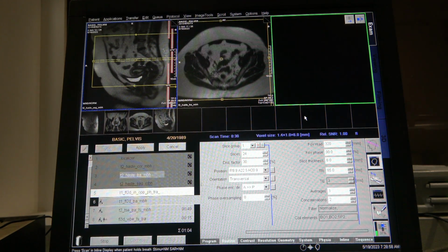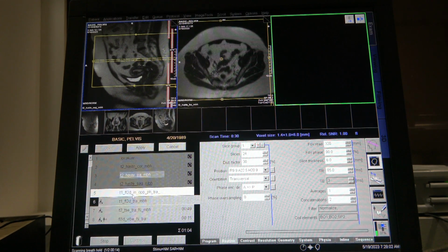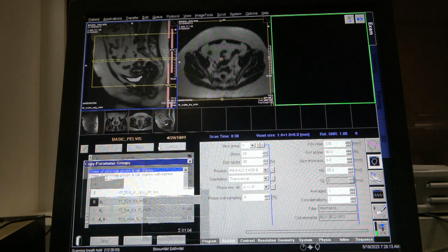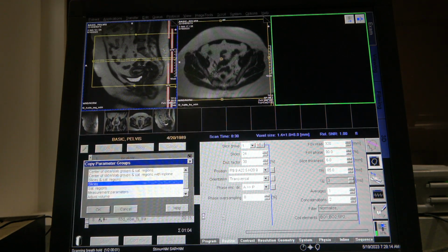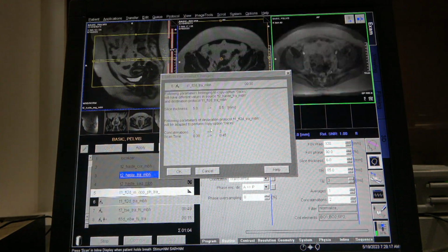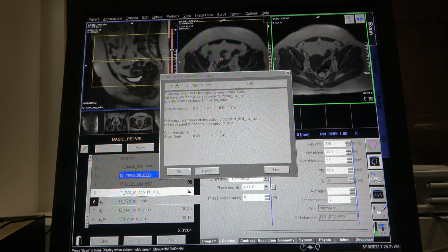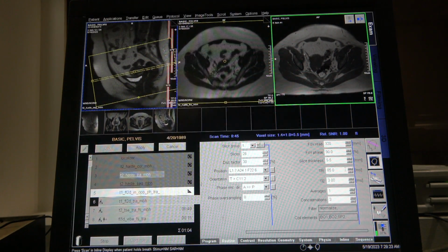All right, go ahead and hold your breath. All right, so let's copy and paste. Now, we don't want to copy from this one, because remember, this one was 5.5 and this one was 5. So let's copy the 5. All right, breathe. Now it's saying again 5.5. I wonder why. Yep, that's as low as it goes.